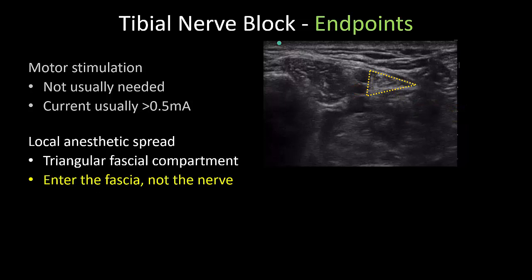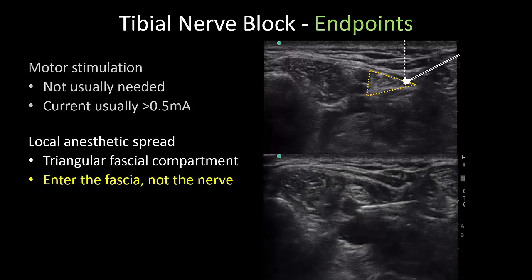Personally, I never use neurostimulation anymore. The aim is to penetrate the triangular fascial compartment that contains the nerve. The needle may be inserted in plane or out of plane to the probe depending on personal preference. I always aim for the posterior corner of this compartment tangential to the surface of the nerve to minimize the risk of penetrating the epineurium. The endpoint for injection is circumferential spread of local anesthetic around the nerve and the needle tip can be repositioned to achieve this. I tend to be more generous with my injection volume for this nerve given its importance and use seven to eight mils on average.